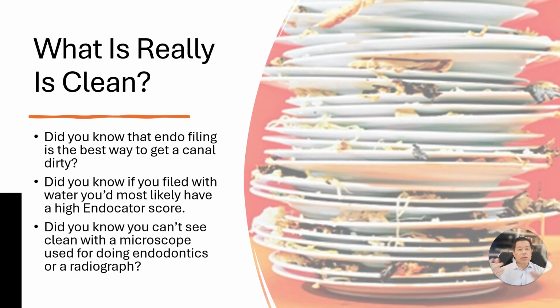If I wasn't using the irrigants that we've talked about during our past programs, maybe I was using sterile water to lubricate my files, to get all that dentinal mud out of there, to rinse it all out. And I might be thinking, okay, now I can obturate because I've cleaned everything out and it looks good. Well, did you know that you really can't see clean?